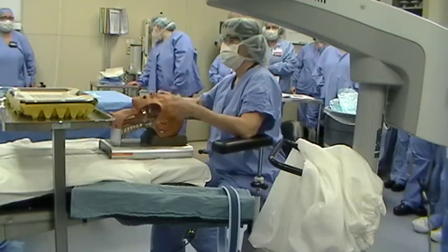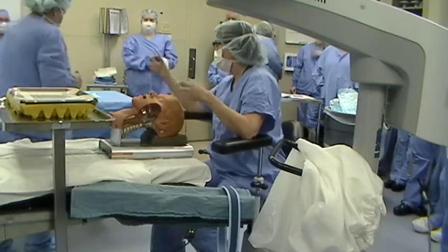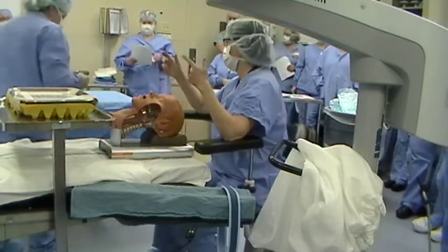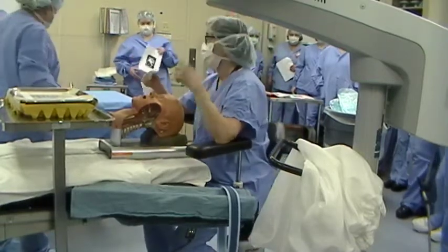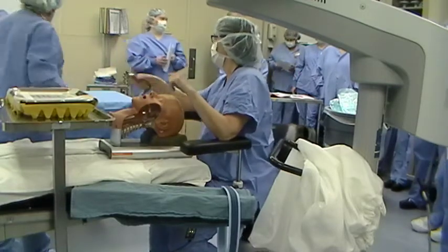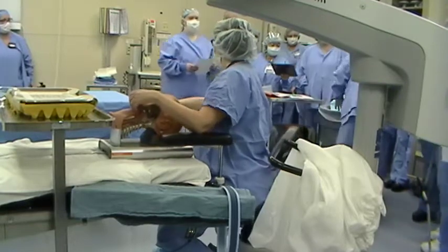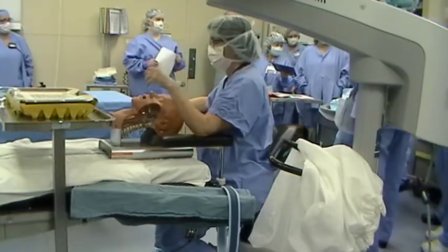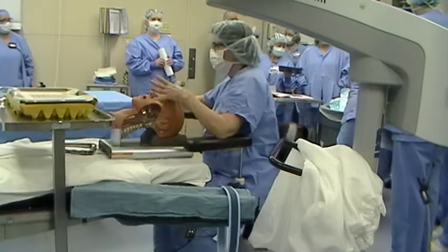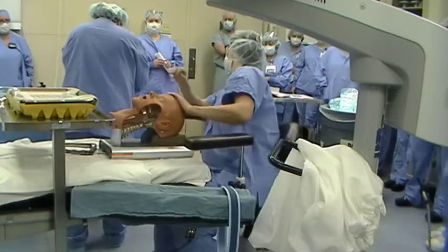The important thing at the beginning is I don't want to knock their teeth out, so we're going to use a dental guard. It goes right around the top. Draping — we don't need to cover everything. This is a clean, not sterile procedure. Think of anesthesia intubating; they don't have special drapes or anything like that. I'm just going to use two towels to drape his head and cover his eyes so the instruments are not going to drip on him.